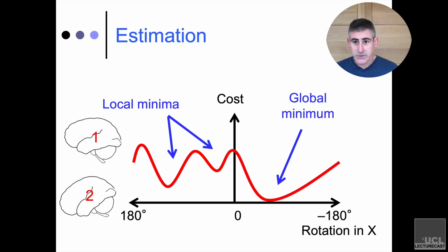The algorithms to do that aren't super complicated, but they're way more involved than I want to get into here. If you're really interested in these things, these are essentially machine learning problems. And I would encourage you, if you're interested in the AI machine learning side of things, then to look at optimization. That's what these problems are. They're minimization or optimization problems. And SPM, FSL, all the software packages have the tools built into them, and they solve it for you.